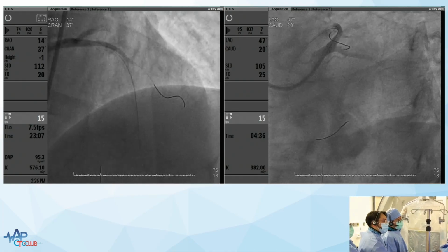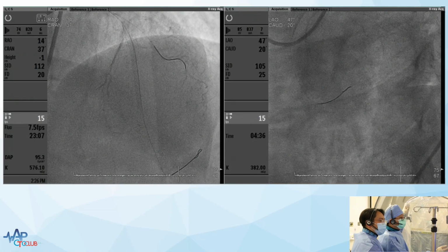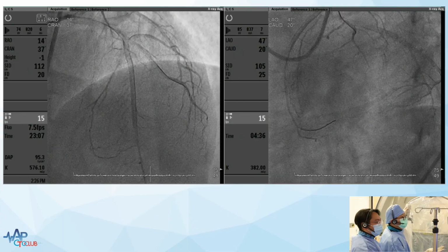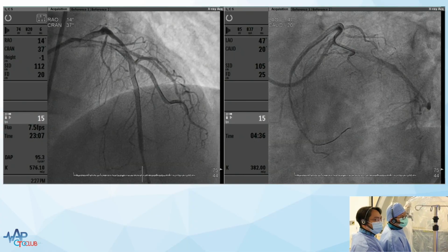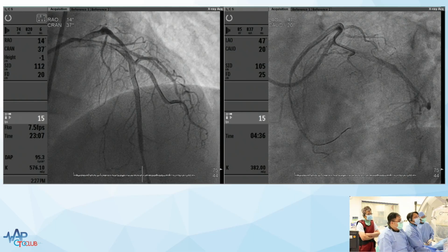And here is the angiogram. But the septal is still not here. Oh, it comes back very late. We have retrograde filling from the distal septal. I think for cosmetic reason we can open up the septal, but I don't think that should have any ischemia. So we maybe have a brief attempt to see whether we can wire the septal and then just open that up. Probably not worth it, right? Yeah, I agree, it's just for cosmetic. You have good retrograde filling, if the distal septal is just supplying the septal myocardium.